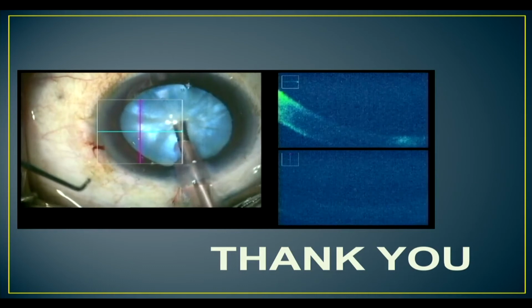Thank you, sir. It was indeed an innovative technique. I would like to ask you, is there a learning curve to this technique? Not really. I mean, it's a simple thing. You just open up the capsule with the phaco probe, which has been described by many. And the only thing that I do is I just make sure that the tip is exposed a lot so that there is no fluid into the anterior chamber, into the bag at all.